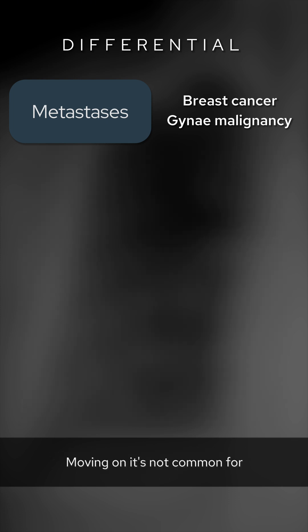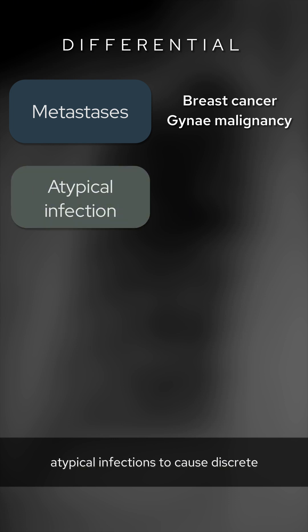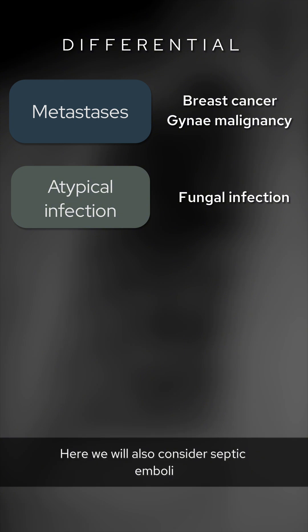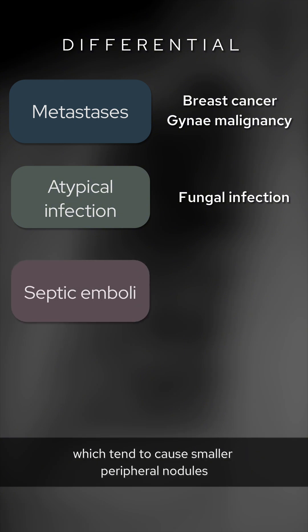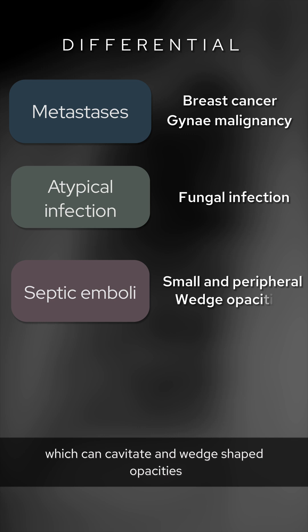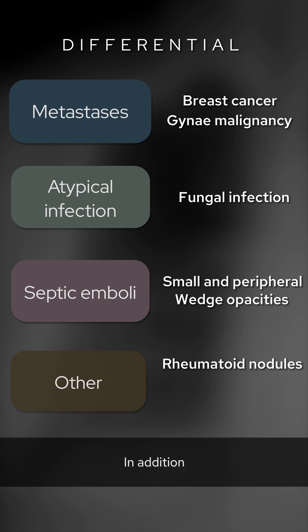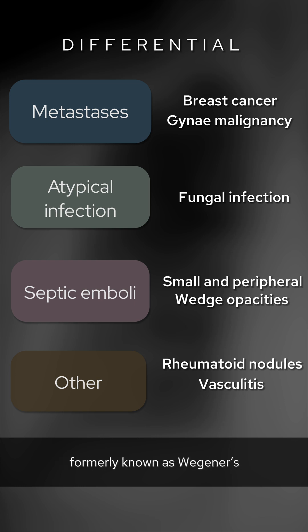Moving on, it's not common for atypical infections to cause discrete larger nodules, but sometimes fungal infection can. We'll also consider septic emboli, which tend to cause smaller peripheral nodules that can cavitate and produce wedge-shaped opacities. Rheumatoid nodules again tend to cause small peripheral nodules and so this is not typical.